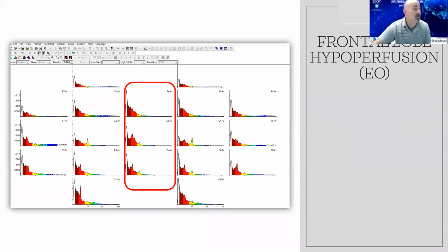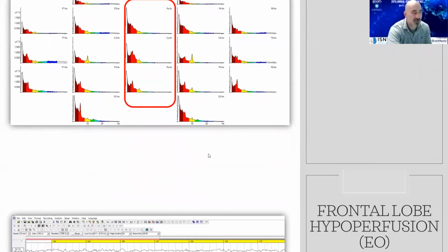So, frontal lobe hypoperfusion. This is what this looks like in the WIN-EEG spectral analysis. This is a different file than we looked at before, but quite similar. And you can see here that there's excess theta at the midline. You can see it frontally. There's even slower activity in the delta range. There's mu left and right. Pretty common feature for ADHD. We'll talk about that a little bit more in just a bit.